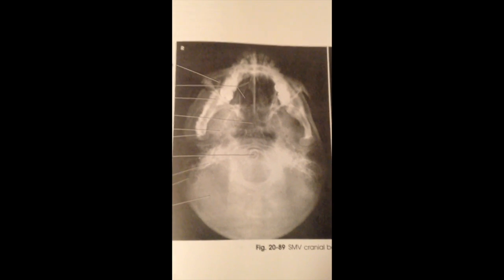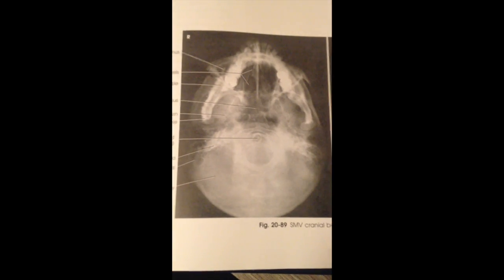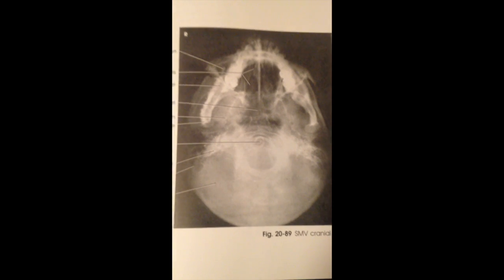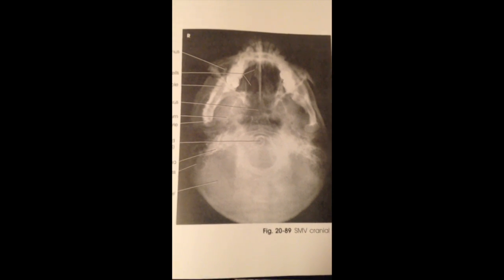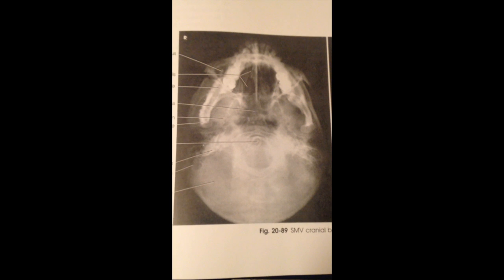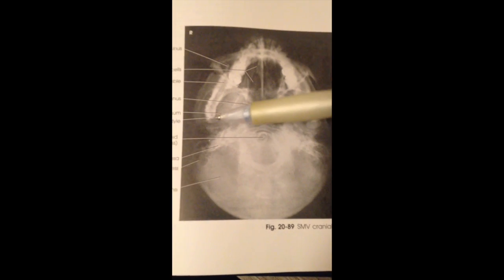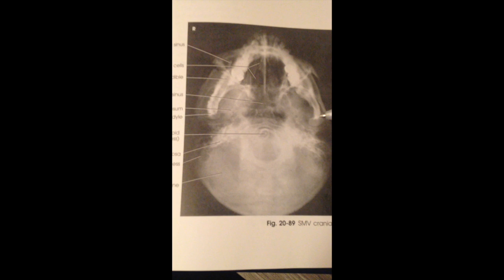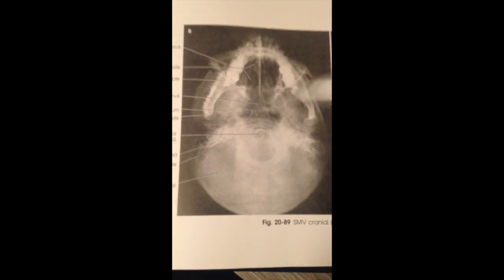It shows evidence of proper collimation. It shows the entire cranium without tilt. It also shows equal distances from the lateral borders of the skull to the mandibular condyles on both sides. Right there. As well as symmetric petrosa.